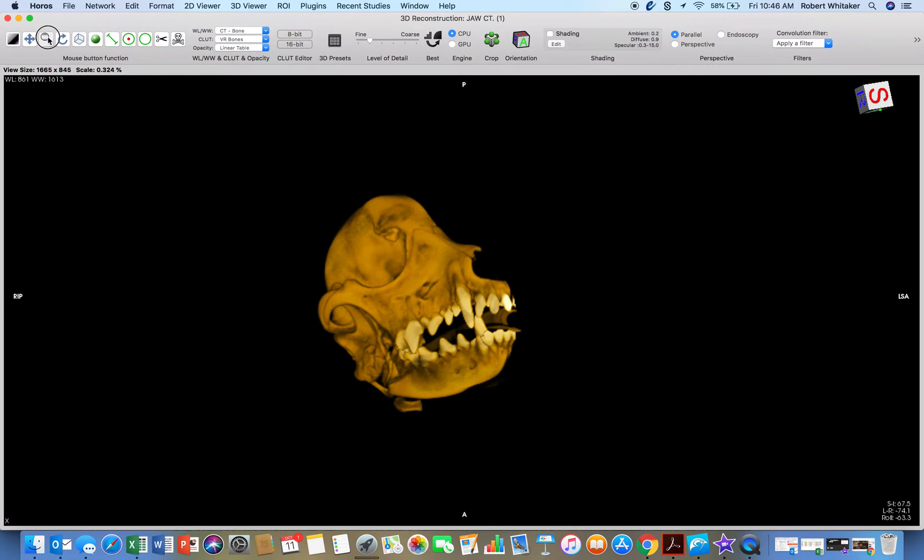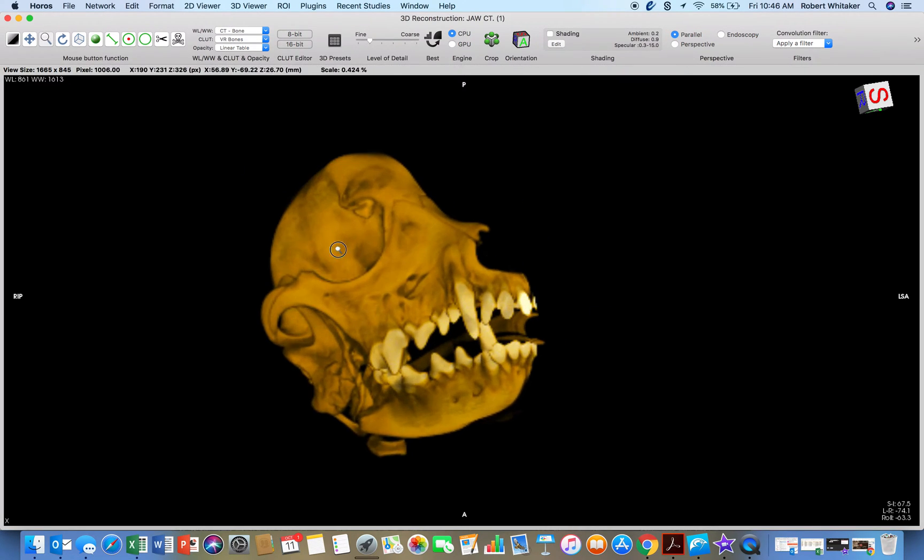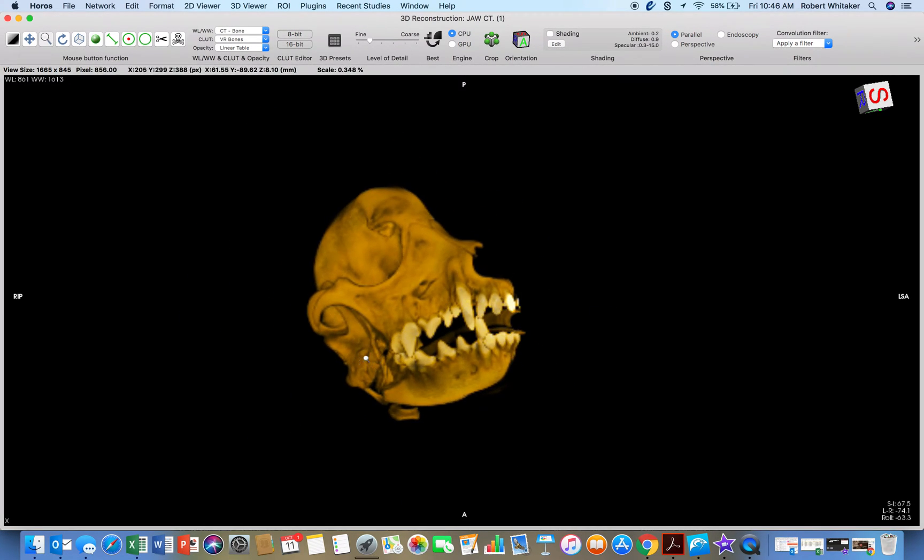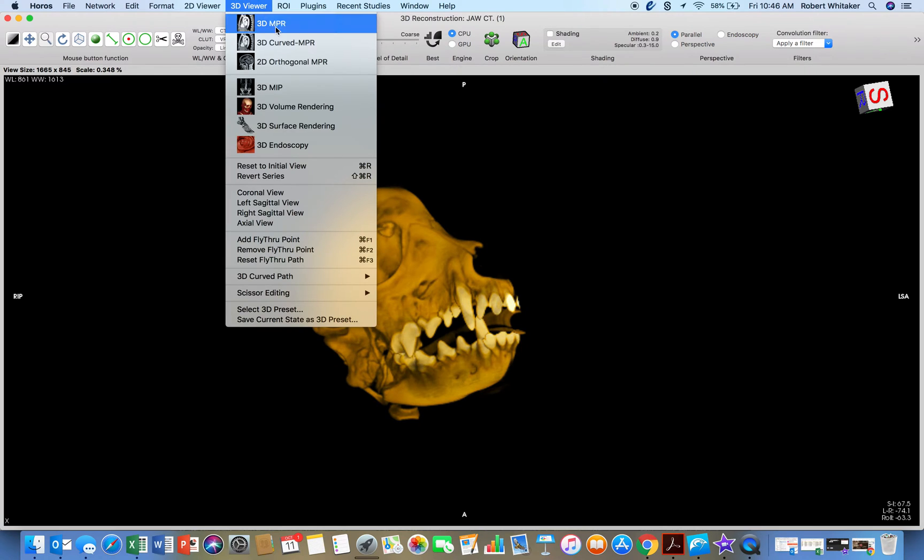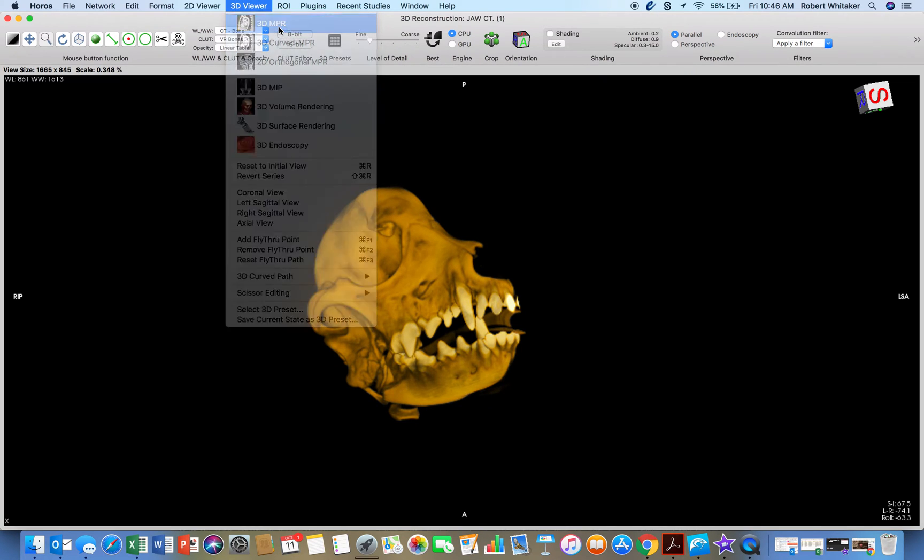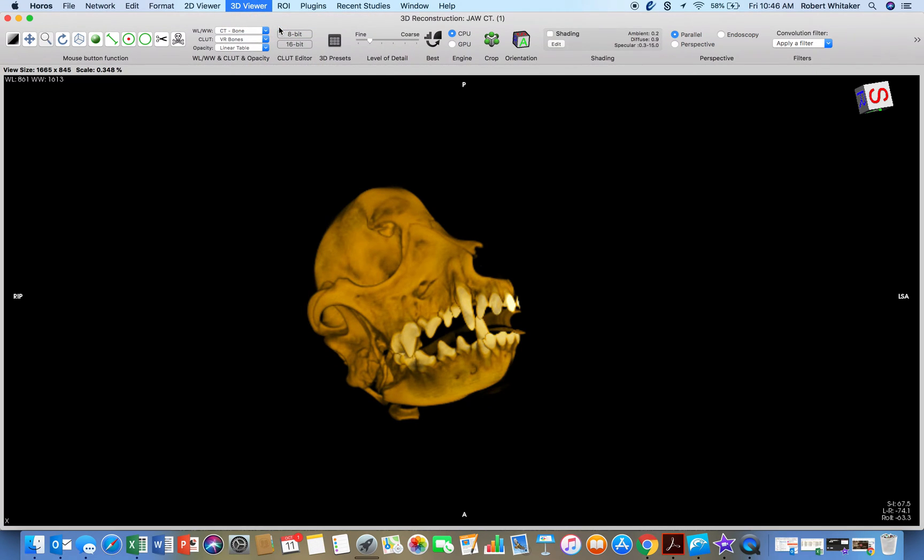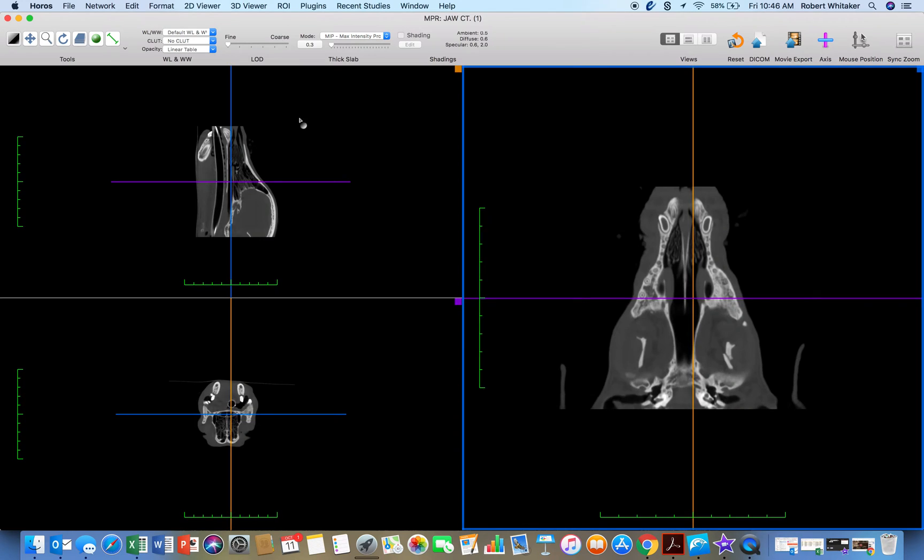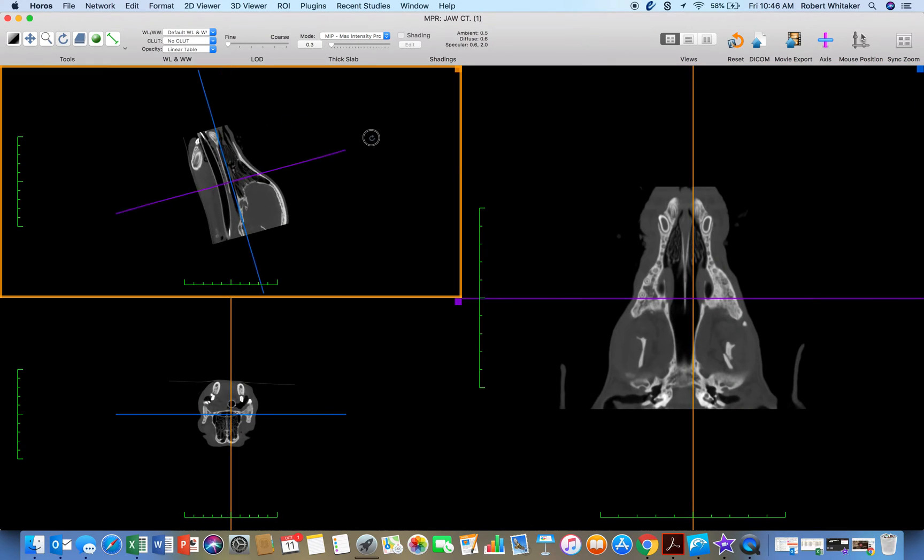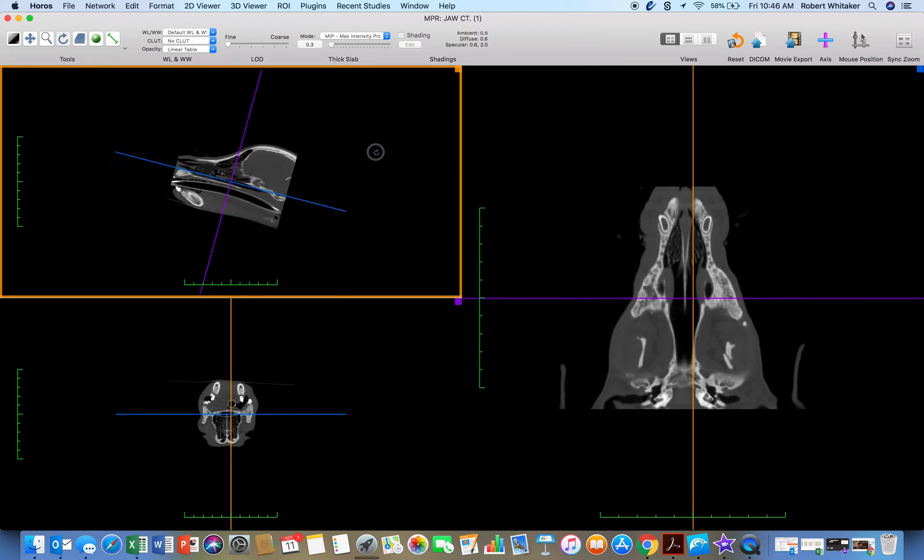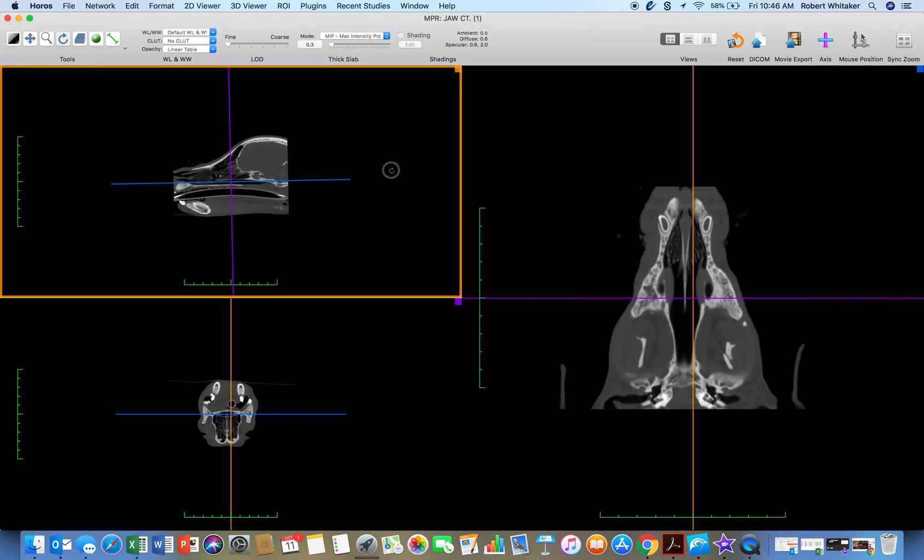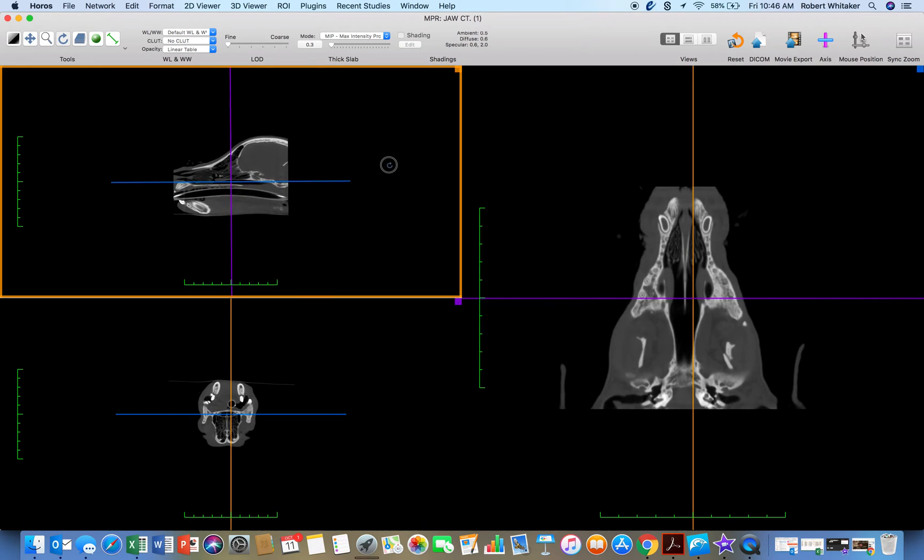This is how you use Horos for dentistry, for 3D. I can also choose Multiplanar Reconstruction. And this is basically the 2D, but three different views in 2D.